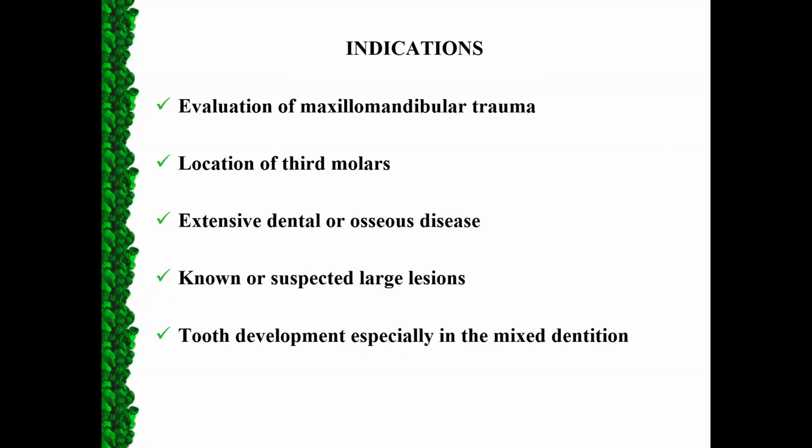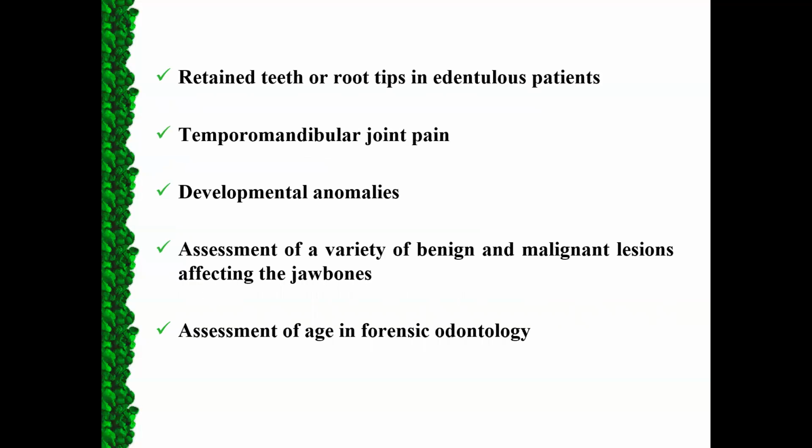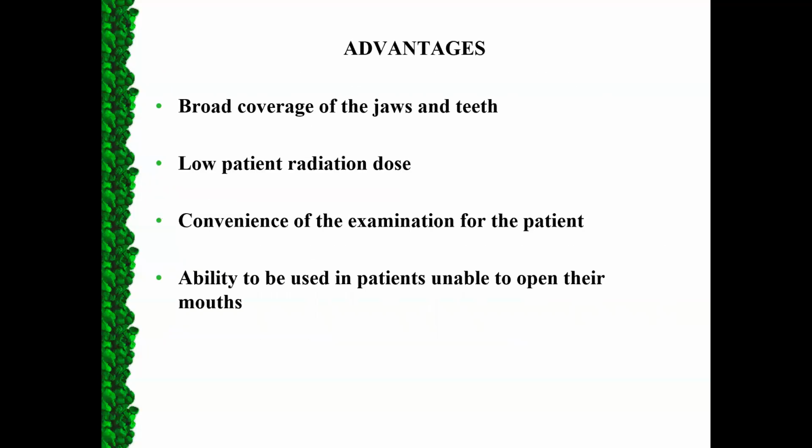The main indications for OPG imaging are for evaluation of maxillofacial trauma, location of third molars, extensive dental or osseous disease, known or suspected large lesions, tooth development, especially in mixed dentition, also in case of retained teeth or root tips in edentulous patients, in case of temporomandibular joint pain, developmental anomalies, assessment of a variety of benign and malignant lesions affecting the jaw bones, and also for assessment of age in forensic odontology.